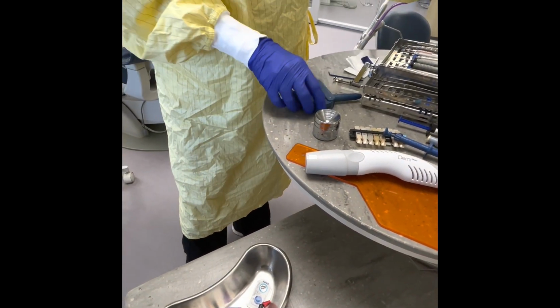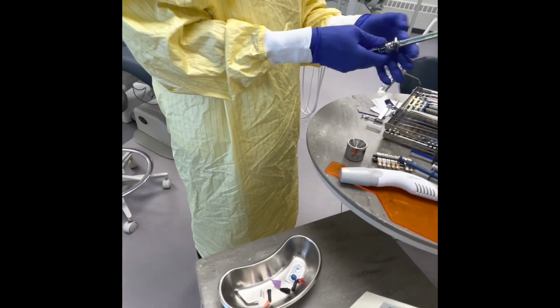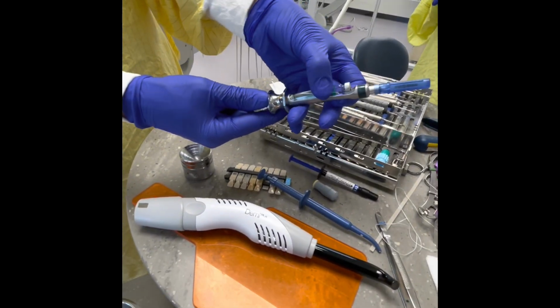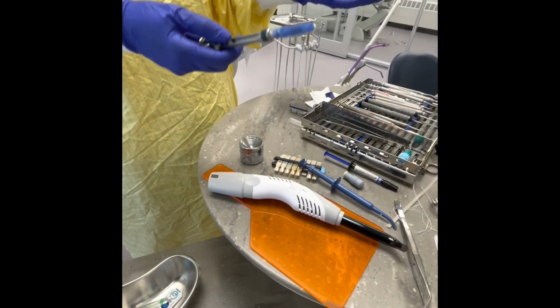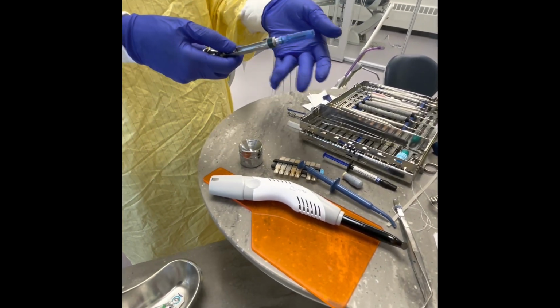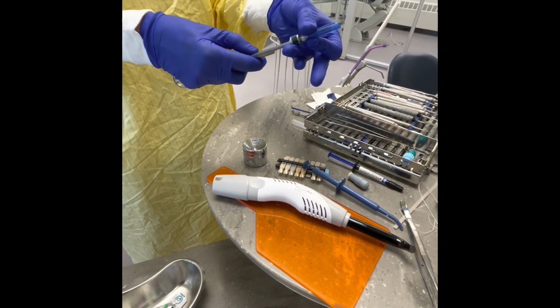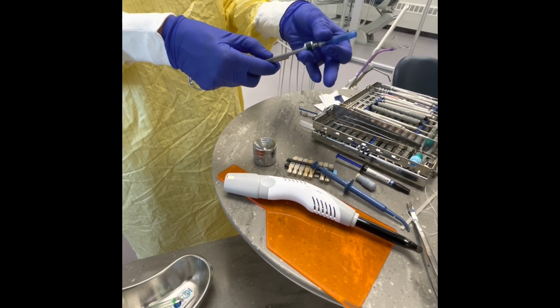What I'm gonna do now is make sure that I disassemble my syringe correctly. Okay, so first thing you do is pull back on your syringe, take your cartridge out, and that will go in your kidney basin. Then what you're gonna do is remove the needle, okay? Make sure you have a fulcrum when you do that. You wanna make sure you're safe when you're disassembling it, just like you were safe when you assembled it.